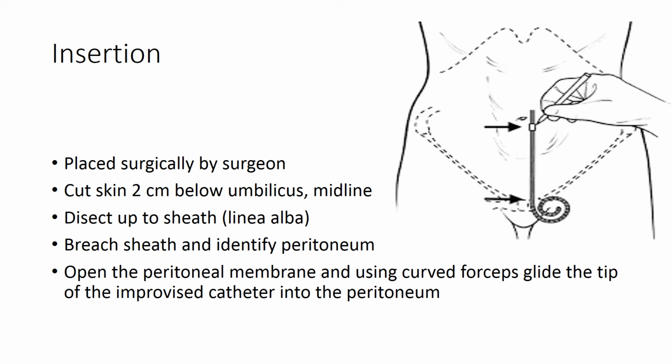And then the other thing is, because the nasogastric tube does not have a cuff, as indicated in this picture, usually our pediatric surgeons would tie a purse string suture at the exit site, at the entry point where the catheter is going in. They use a purse string to secure it so that the tubing does not come out of the patient and disrupt this life-giving procedure.